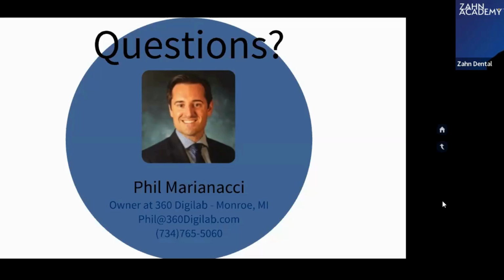And really, I've seen quite a few times with Nemo Studio how it can detect where the major nerves and the major blood supply are. There's no more guesswork. It's pretty amazing, this software. Yep. Let's see if there are any other questions for us.